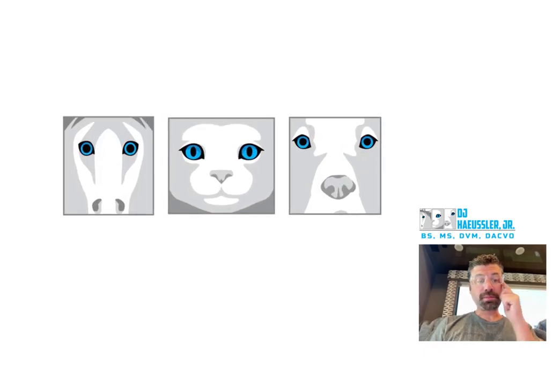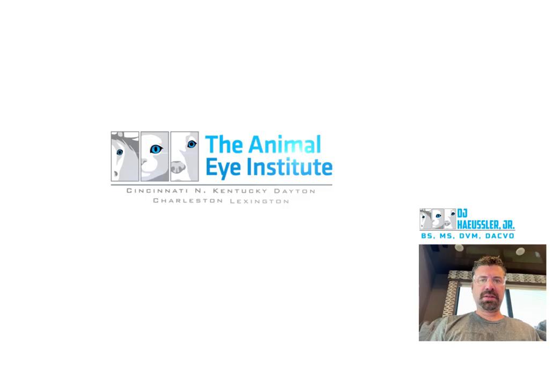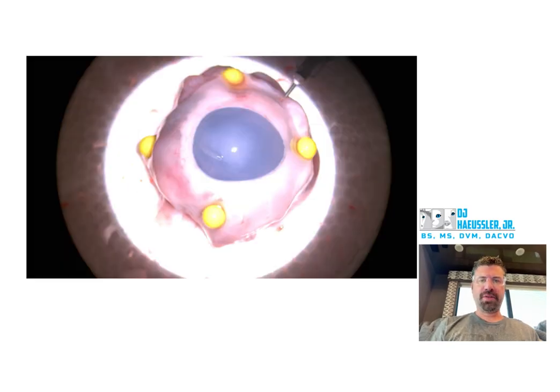All right, here's the next conch craft on a pig eye. This is accelerated to 2.5x just to improve efficiency. So here we go.